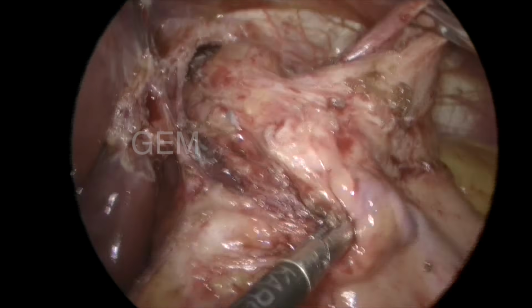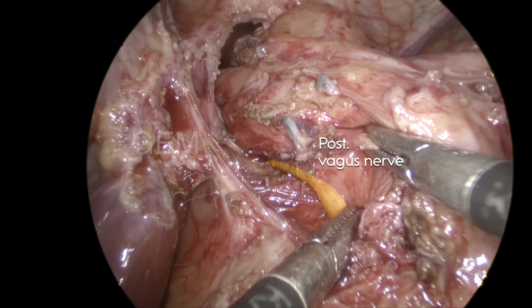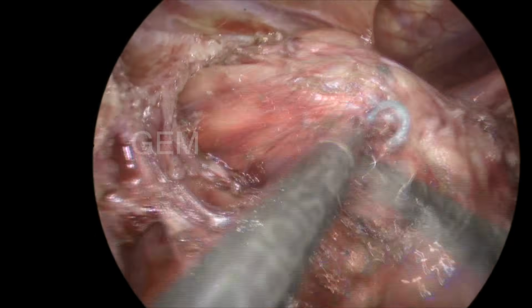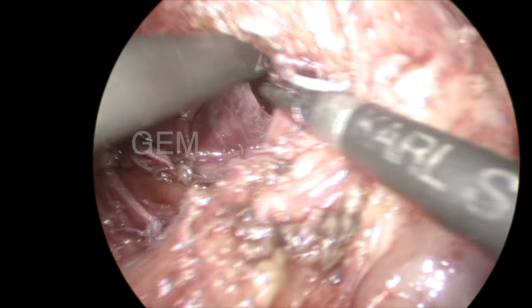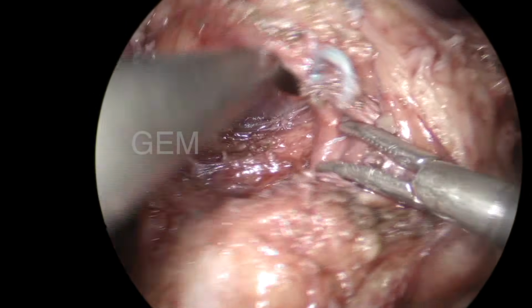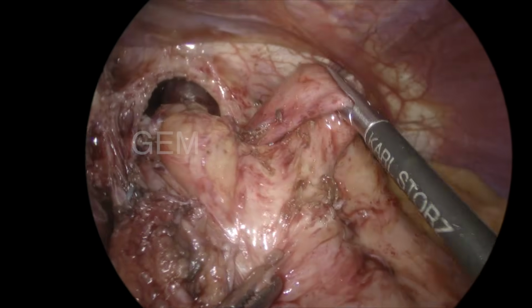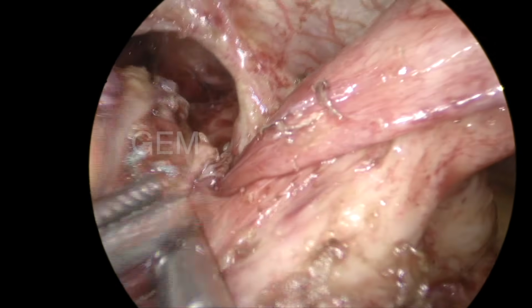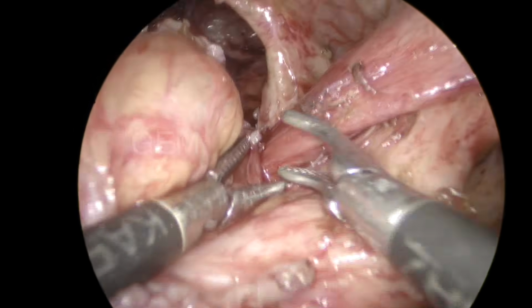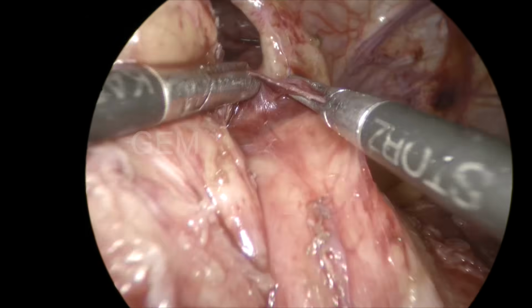Your team should accept, so that is again the post vagus I am marking, because it should not be injured. That's why I am marking it repeatedly. Your team should accept that your decision is correct, what you dissected is correct. If everyone accepts, then you can proceed confidently. So that is called culture of safety. In redo surgery, all those things are very important.